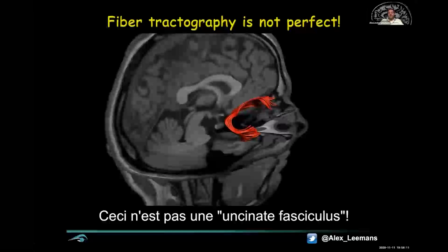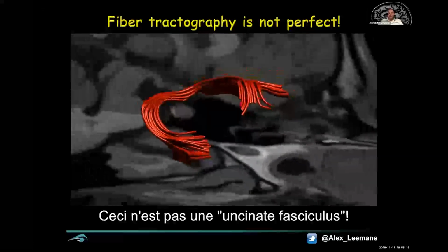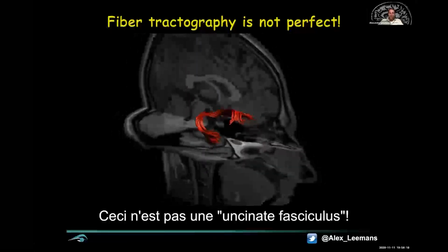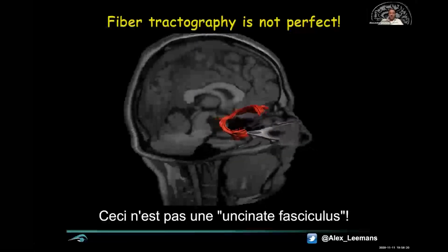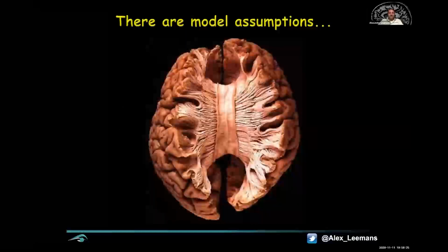But we make assumptions, right? I mentioned the diffusion profile. I said we can look at it as a three-dimensional multivariate Gaussian, also known as the ellipsoid. You could think of it as an isoprobability function. But in practice, if we look at these fiber bundles like this, it's actually more complicated. This is a Klingler dissection, which also breaks down tissue, so subtle connections and crossing pathways are not really depicted in this way. And this also holds for ex vivo dissections, right?